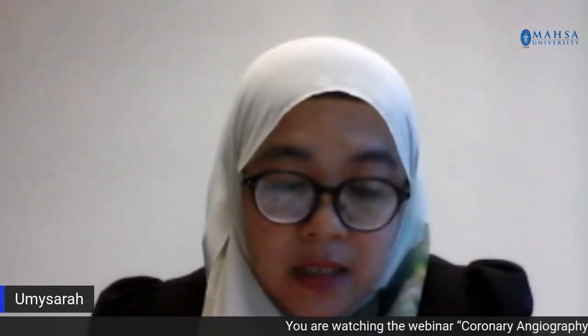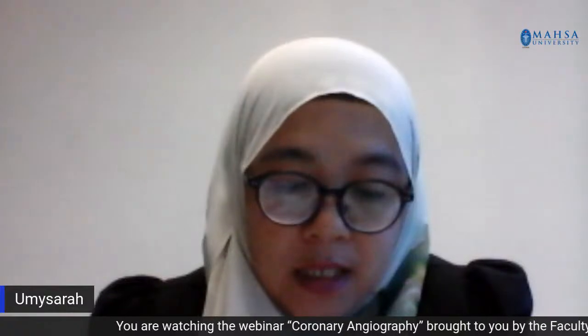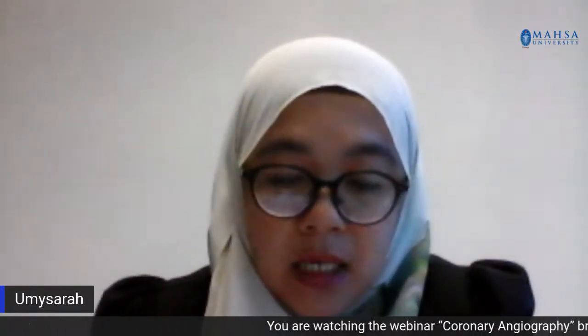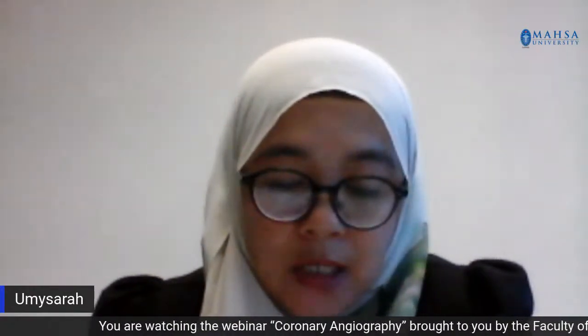Before we proceed to our webinar, let me introduce a bit regarding the topic today, coronary angiography. Coronary angiography is known as a gold standard procedure for diagnosing coronary artery disease. Atherosclerosis is the hardening of blood vessels due to plaque formation in the coronary arteries. This condition leads to narrowing of the blood vessel and restricts the blood supply to the affected body part. Coronary angiography refers to imaging the coronary arteries, the blood vessels that supply blood to the heart tissue, with the use of contrast media and the C-arm fluoroscopic modality. This webinar will focus on the clinical indication, materials and equipment, technique, as well as the projection of the images produced during the procedure.